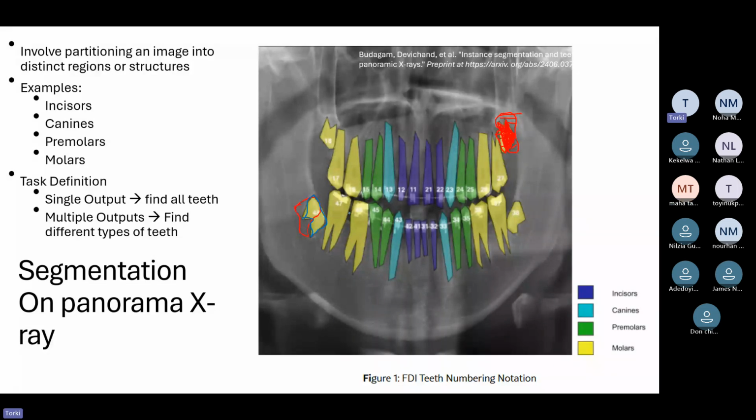Okay. So you would like to compute the overlapped area. You are doing this with dice and IoU. But if you'd like to compute the quality of the boundary that you predicted, which is the red one, against the boundary which is the ground truth, which is the blue one, you compute point-to-point distance. So you find which point on the blue curve is closest to this point on the red curve, this one, this one. There is a very huge distance between two points, right? This is the closest one.